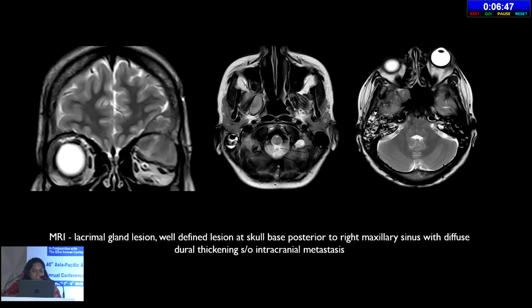On MRI, it was noted to be a lacrimal gland lesion with a well-defined lesion at the skull base posterior to the right maxillary sinus and with a diffuse dural thickening, which was suggestive of an intracranial metastasis.